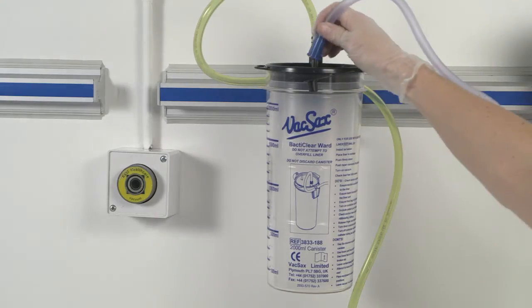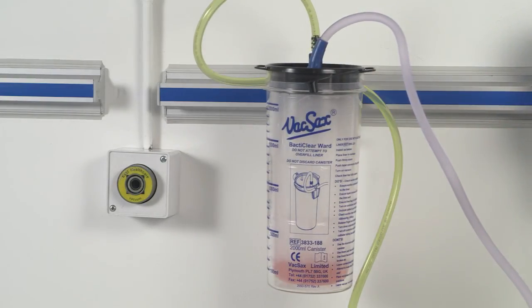Connect the patient tubing to the patient port. The suction unit is now ready for use.